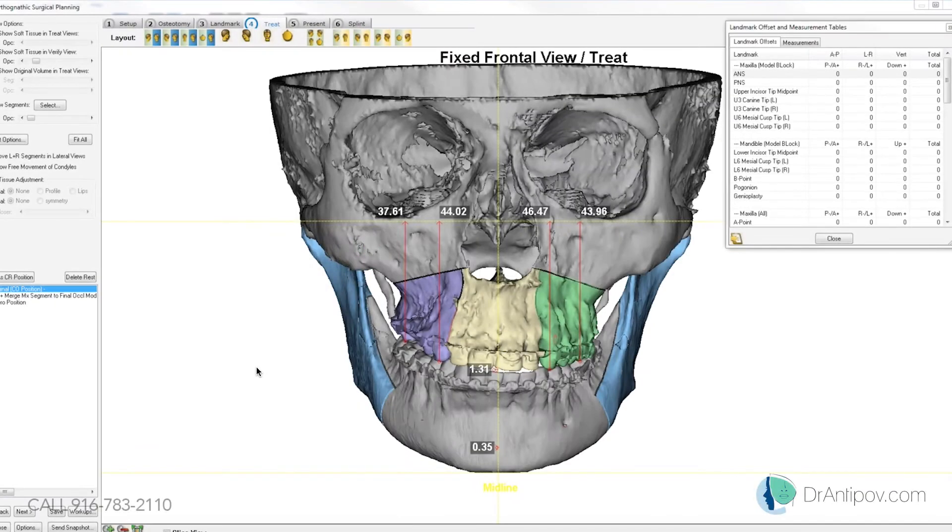Yeah, there was a clinical cant — the right canine is about 4 millimeters higher than the left one, 3 to 4 millimeters higher. And then were you seeing the midline as being on with facial? The midline is approximately 1 to 1.5 millimeters to the right side, but the midline is canted as well.